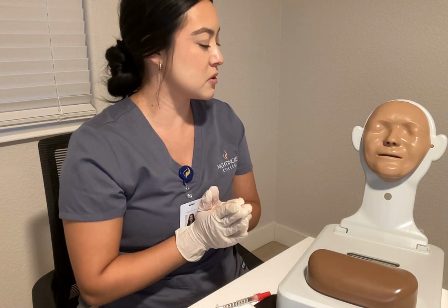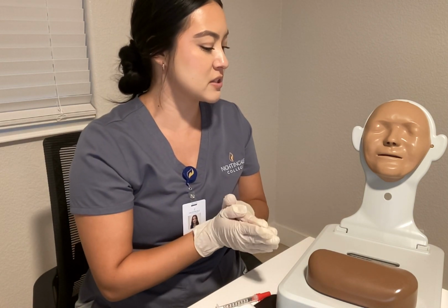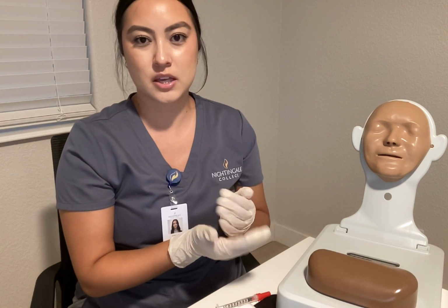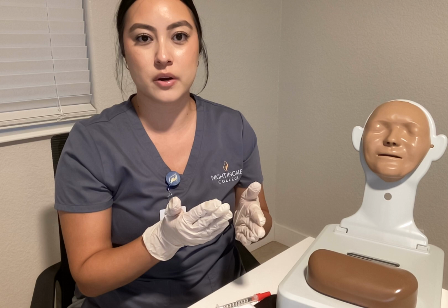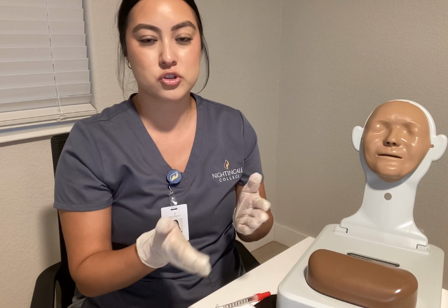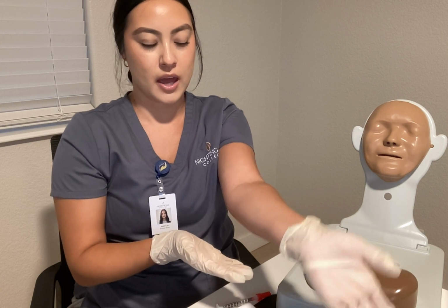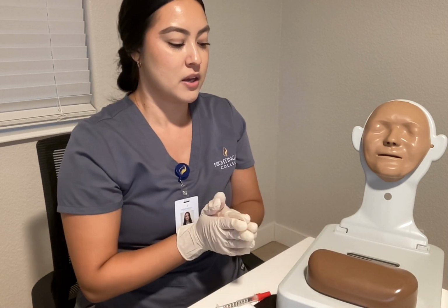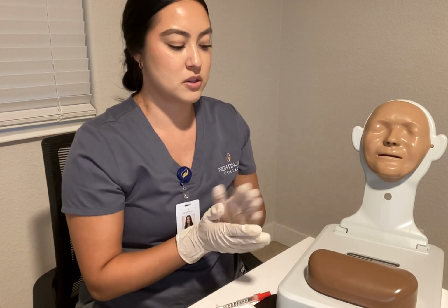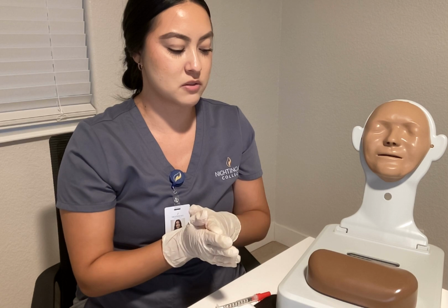Perfect. Okay, Mr. Smith, so we're going to go ahead and inject the medication. If you can, just stay as still as possible. In this instance, if the patient was sitting in a chair or I had a tray available, I would move that and then rest the patient's hand comfortably on that so they're not holding it, anything like that. In this instance, the patient has just had it comfortably in a correct position for me and the patient.